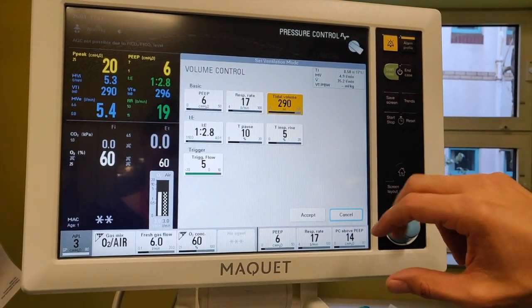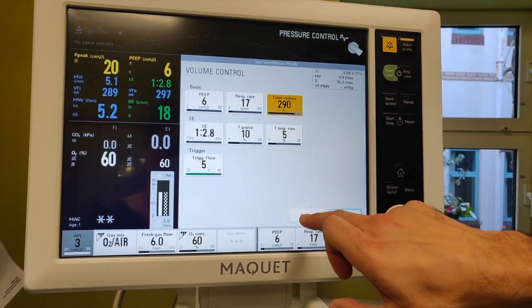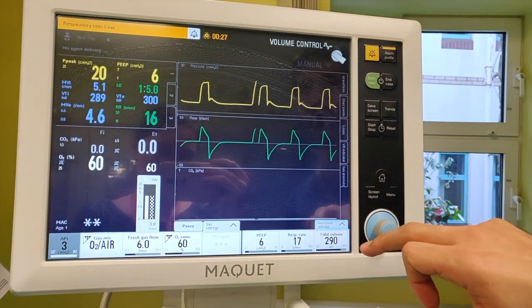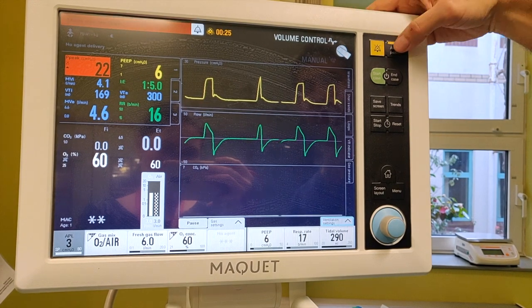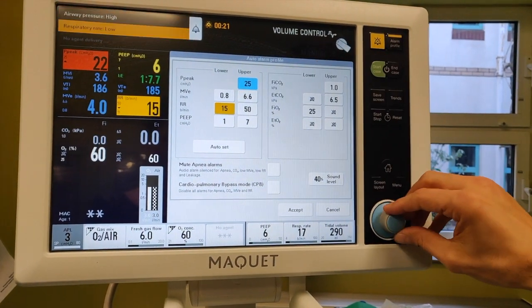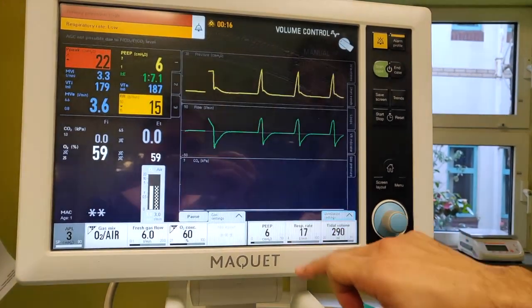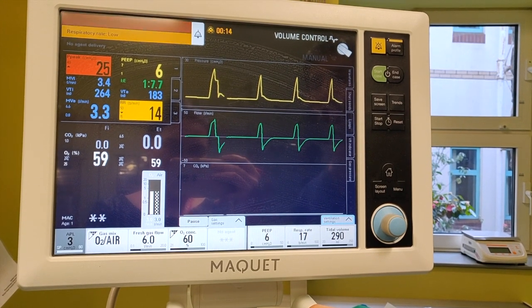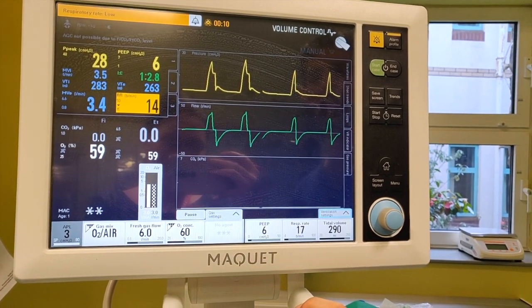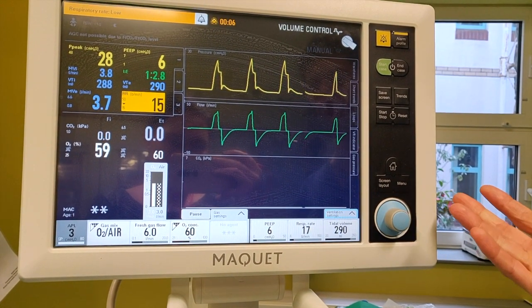They look relatively sensible to me, and I'm going to press accept. So what's going to happen now — because my pressure alarm is set wrong, it's shouting at me. I'm going to flip this up to something that's much more sensible. And there you are, ventilating in volume control.